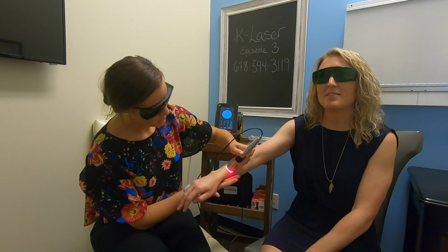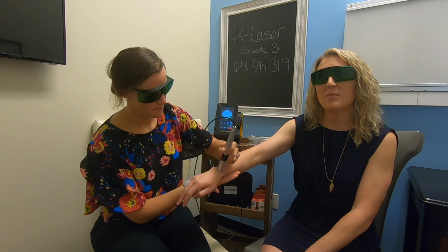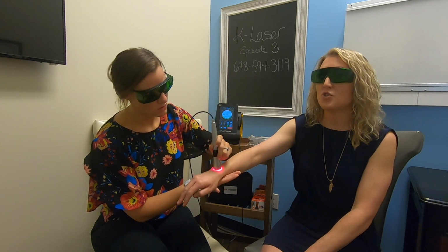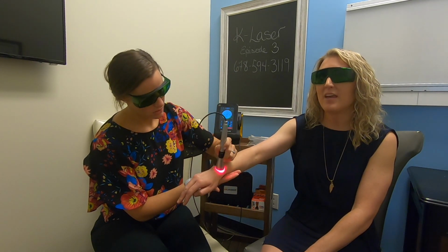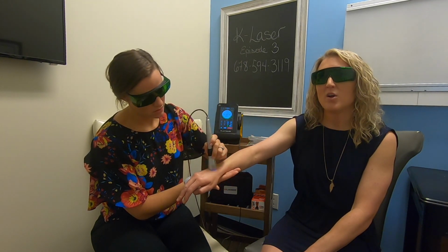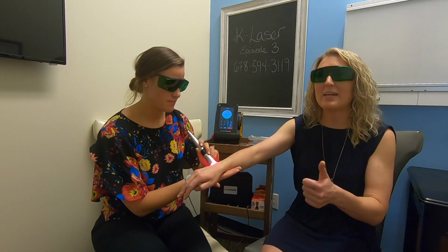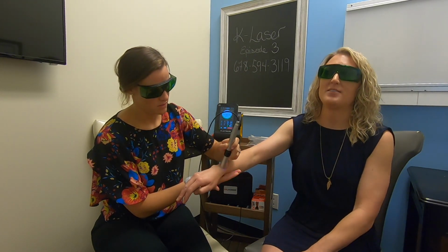We were talking about last time the strength levels of it. This has 4. It has a 650 nanometer, which means it's a super, super small measurement in length, and that goes through the skin. Then you have an 810 nanometer, which is for ATP. So basically what that means is when ATP increases, energy increases.